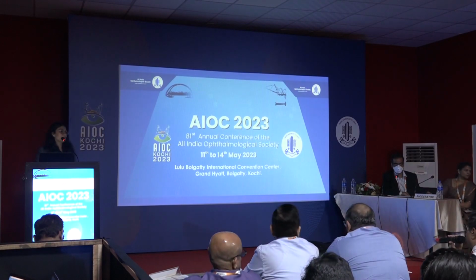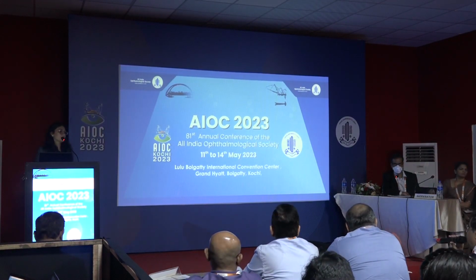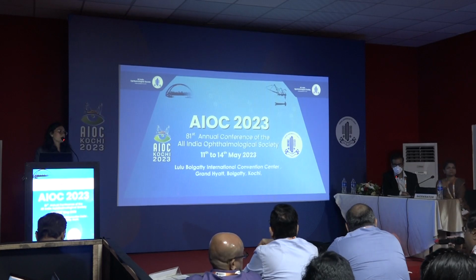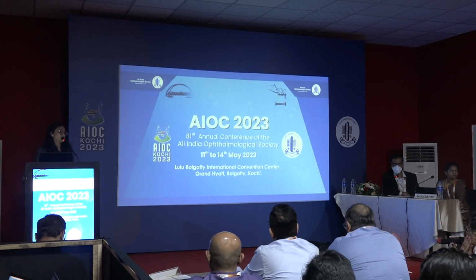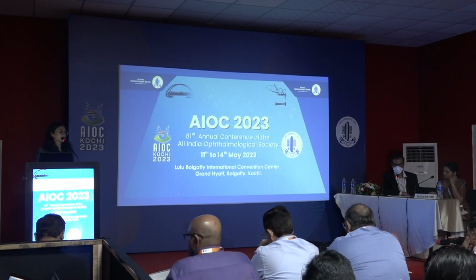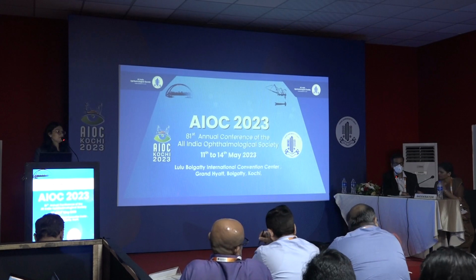I think it requires a lot of skill, and the risk of hemorrhage is there, in case it bleeds. So maybe a safer way of staining and finding. Basically, you're using the staining technique to find out. Yes. Now reaching the stain to the location is another challenge. Yes. So, any other comments?